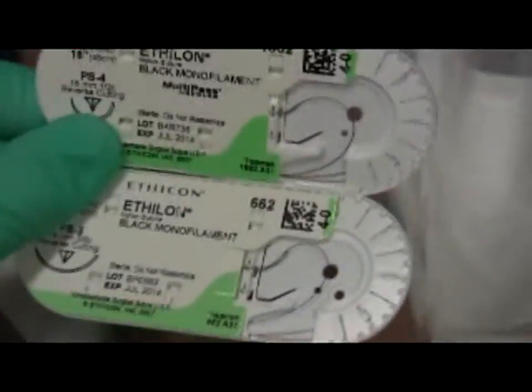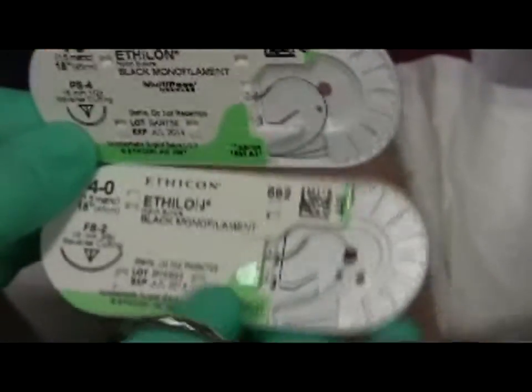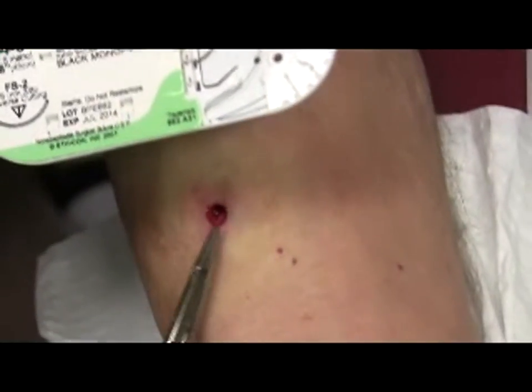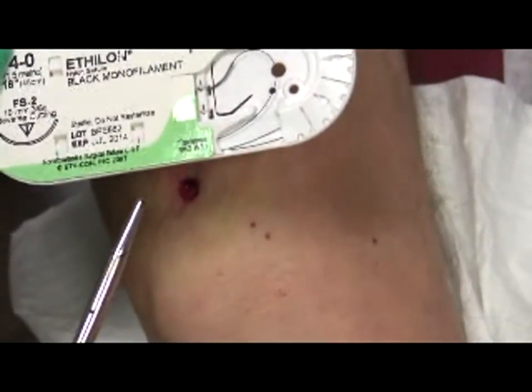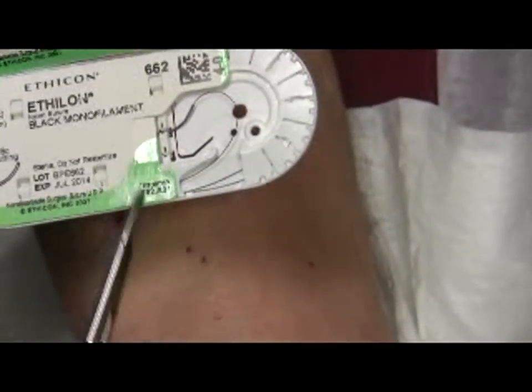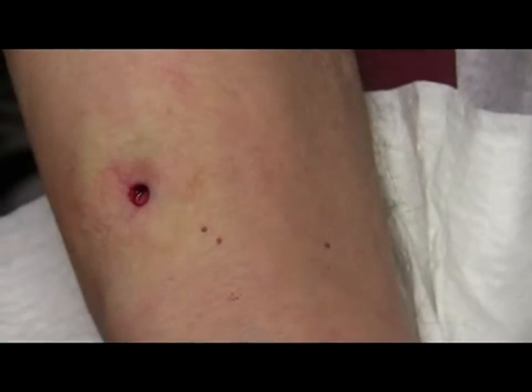You have two flavors of stitches you can use. You can use a larger needle or a smaller needle. In this case it's kind of arbitrary. For the purposes of this video, I'm going to use a larger needle so that people can see what's going on.